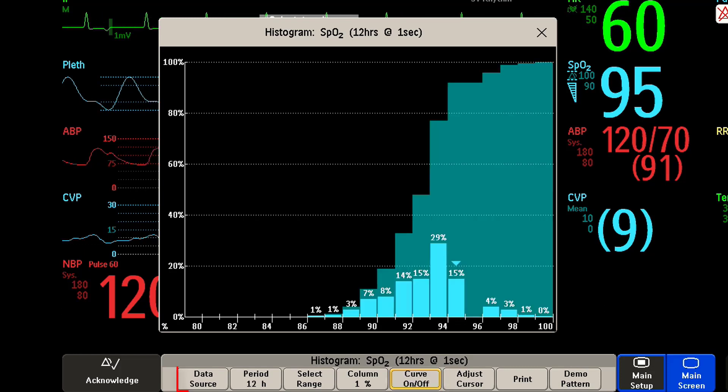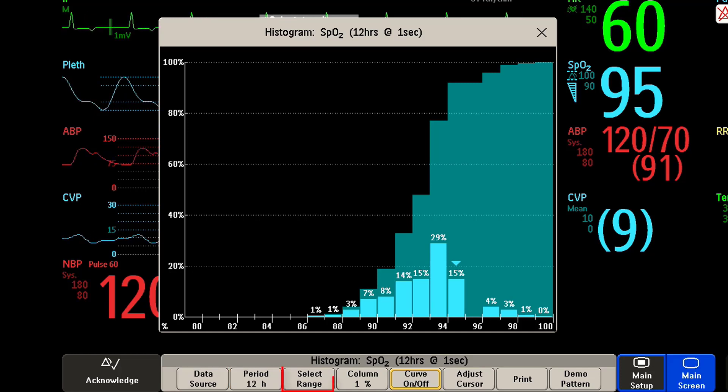You can also use the pop-up key to change the measurement, the time period, or the range, and you can print the histogram report.